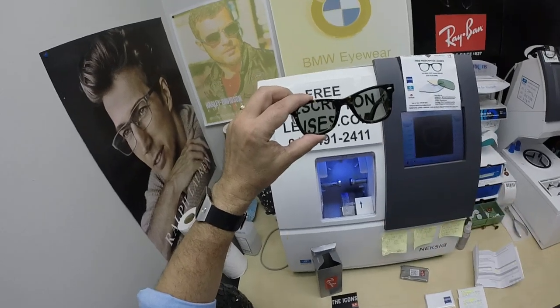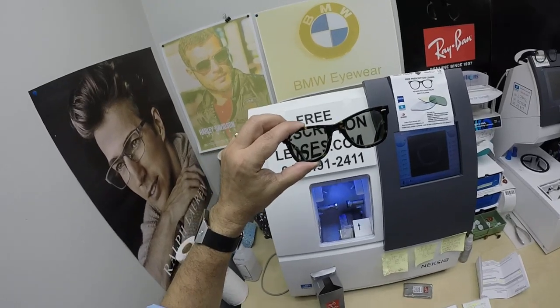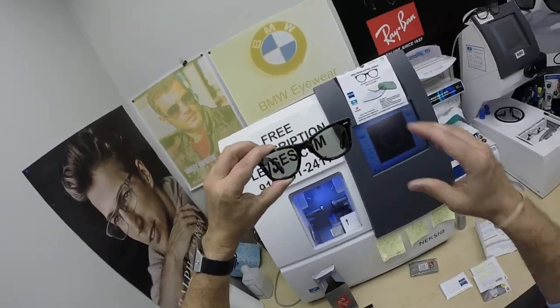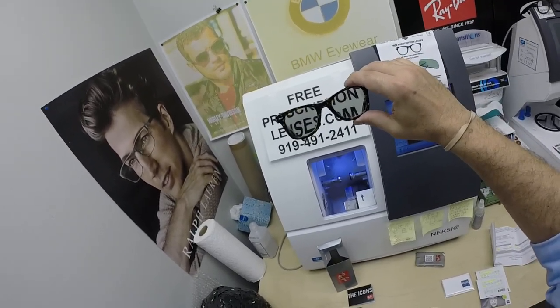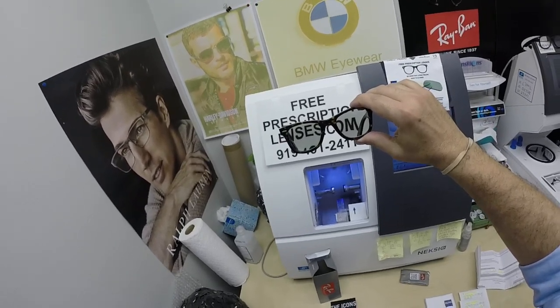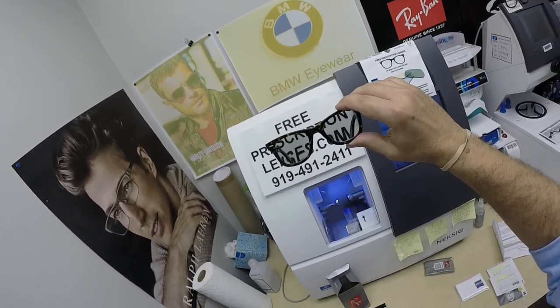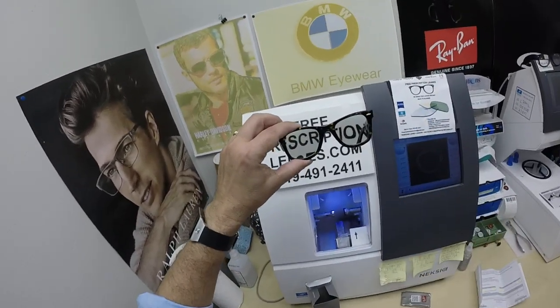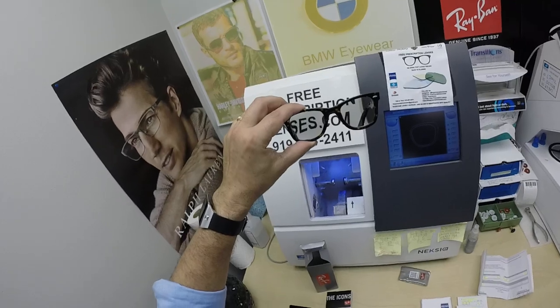The other nice thing about these Photofusion lenses is they were the original blue-blocking lenses — they block about 30% to 50% of the harmful blue light emitted from today's electronic devices: cell phones, computer screens, tablets. You can see how fast these are turning back to clear. Zeiss sent these to an independent lab to be compared with the Gen 8 lenses from Transitions. These turn four and a half times faster to dark, and one and a half times faster from dark back to clear — and that was a blind study, not Zeiss testing. Zeiss came out on top.